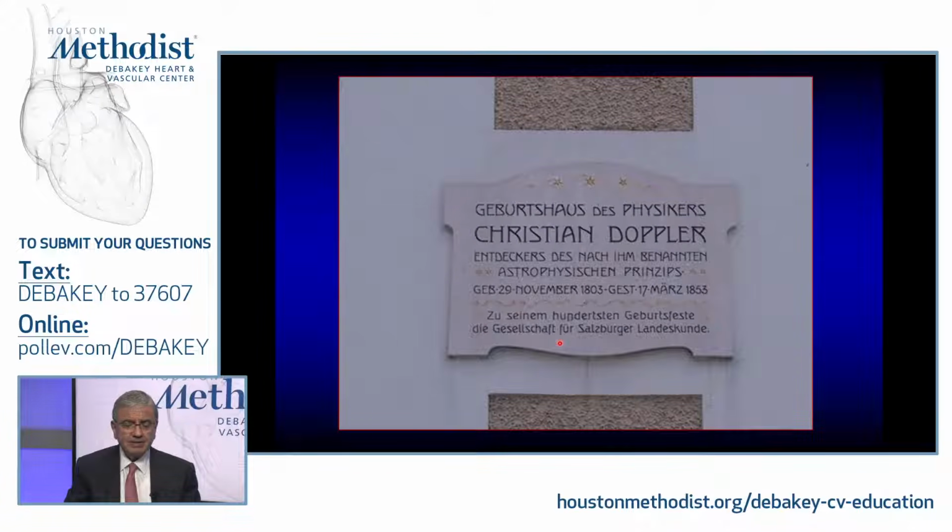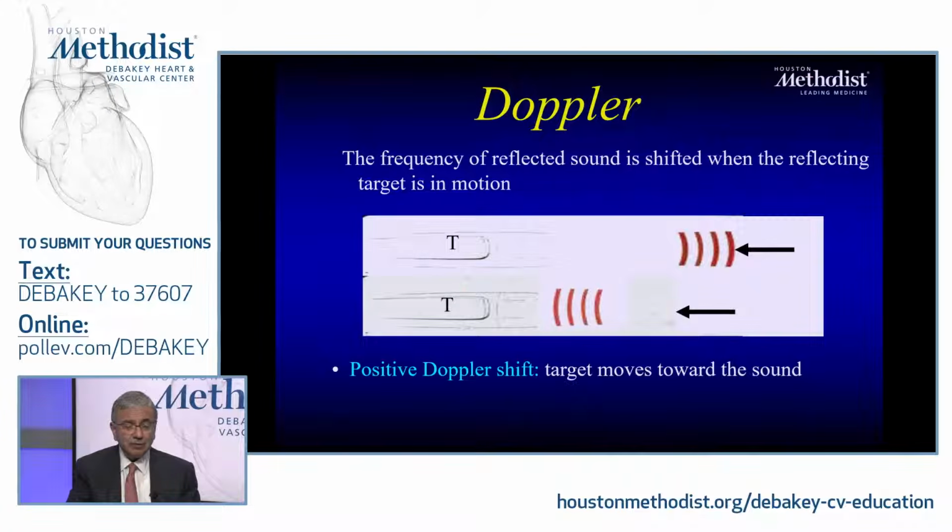It is really amazing what they were able to do back in the 1800s to come up with the Doppler equation, which tells us about a frequency shift of the wave in relation to the movement of either the object itself or the detection of the object itself. And this was delineated, and the equation gotten from movement of the stars, believe it or not. So it really is amazing how you're able to do that.